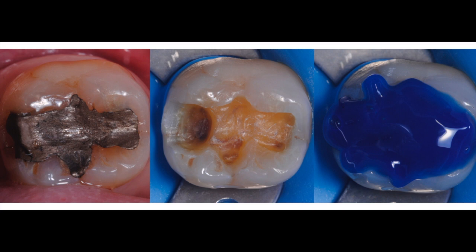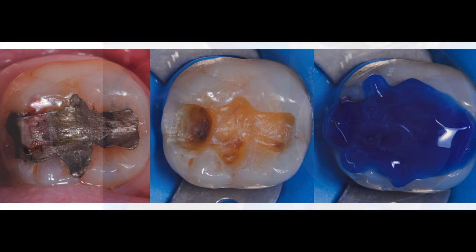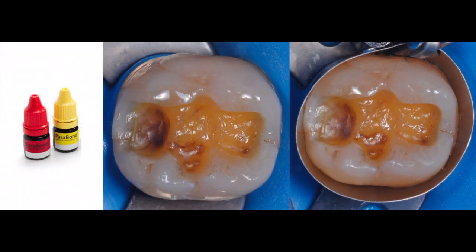After removal of the fractured amalgam and carious dentin, a 15-second total etch technique is completed. We mix one drop each of Parabon A and B and apply two to three coats to the dentin and enamel with a rubbing motion. We eliminate the excess and the solvent with a gentle stream of air for 5 to 10 seconds.